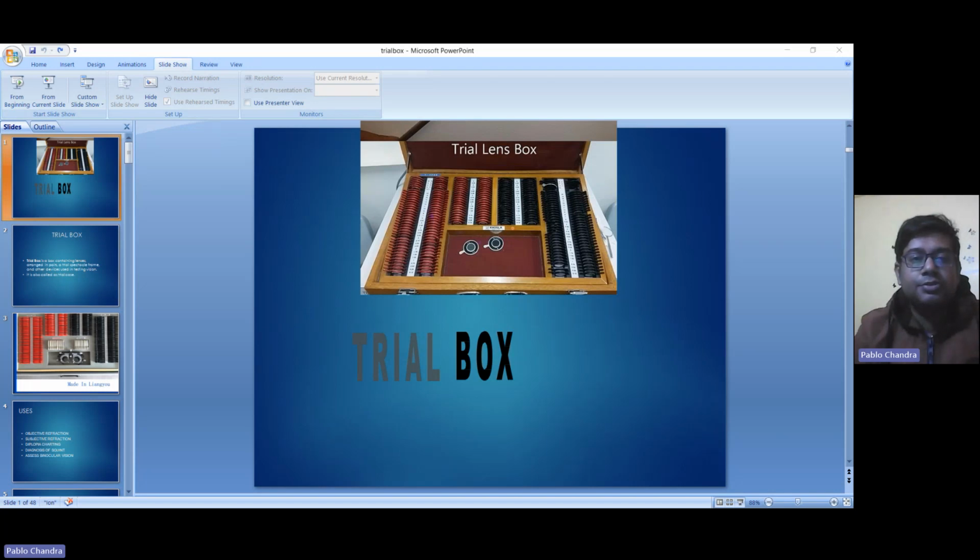So there is a prismatic effect produced. The power range is 0.5, 1 to 6 diopter in one diopter steps, and in two diopter steps we can change the power of the prism. It is used to correct and measure strabismus. What is strabismus? It is squint. You can see a child showing squint. Whenever there is a squint, prisms can be used for measuring the squint. They can also be used for correcting the squint with exercise.